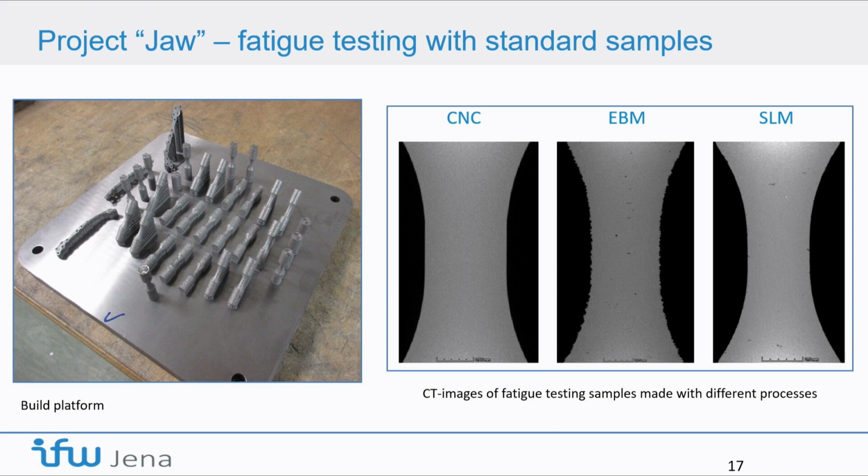There are typically other approaches, to have a polished sample, test it, and then add safety factors. But in our opinion, due to the young age of additive manufacturing, you cannot really determine the safety factors, and that's why we test with a real surface, and then we have data about what really happens.